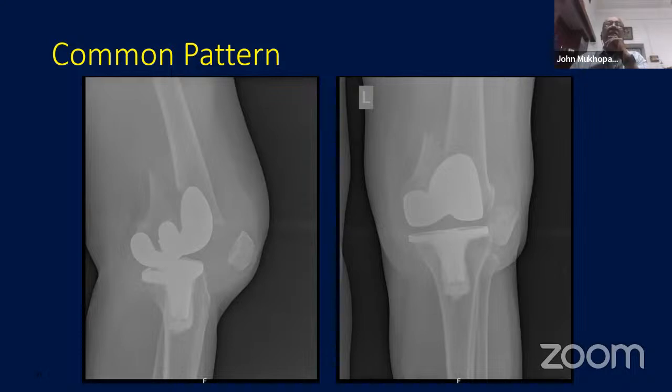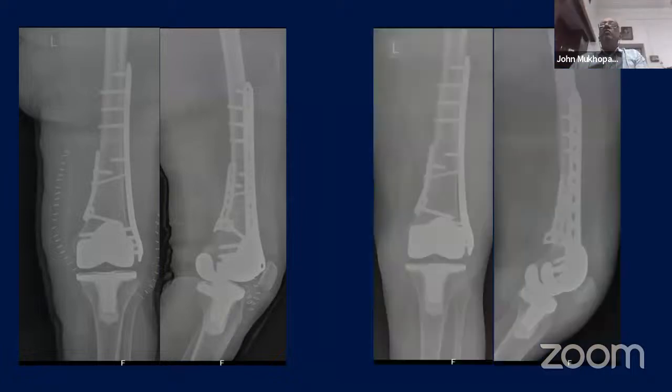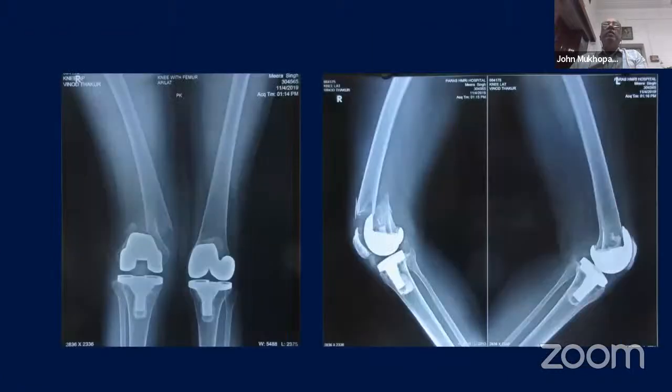Now, this makes it almost important to actually buttress that medial beak, and often this is posteromedial, okay? So you may have to buttress this and then use a long bridging plate on the lateral side, something like that, and you can see how this has then gone on to heal well. Okay, so you can see it's a posteromedial plate.